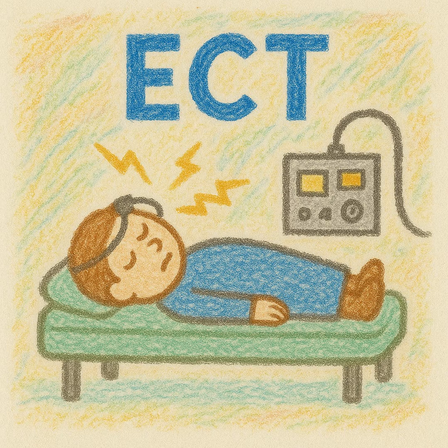Again, we're going to start with 6 and then we might creep up to 7 or 8 times if we need to. We're going to be paying attention to seizure quality metrics. The data and evidence on this is very limited. One thing we want to see is that someone's having at least an adequately long seizure. Depending on the source you're looking at, this could mean at least 15 to 20 seconds long.